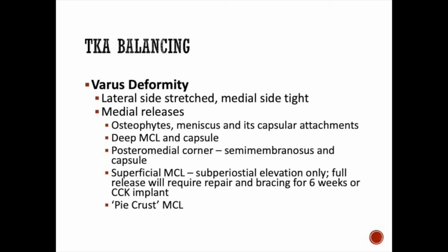These are sequential releases, so you don't do all of this. You do one, check your gap and your balance again, do the next, do the next, do the next in that order, and stop when you've reached your equitable tensions.